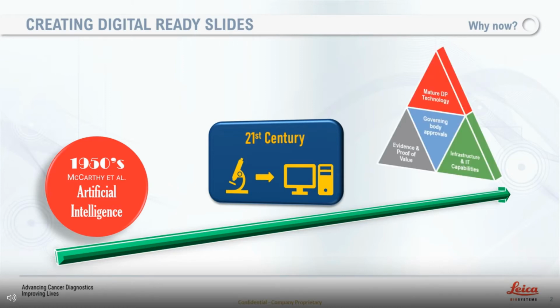We're now at a stage where the maturity of digital pathology technology is suitable for true high throughput routine usage. You also have acceptance of the usage of digital pathology by a number of the governing bodies and regulatory bodies in different regions across the world.